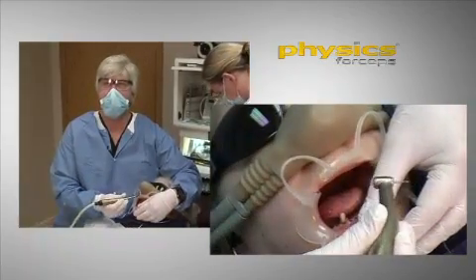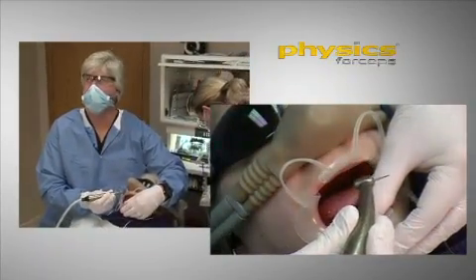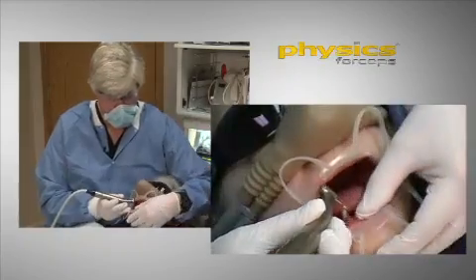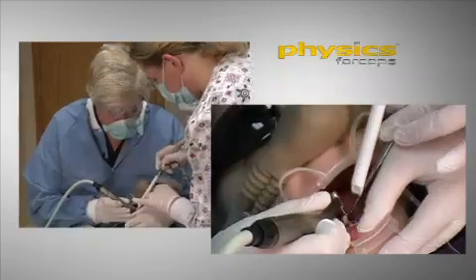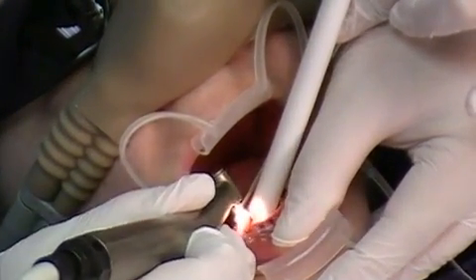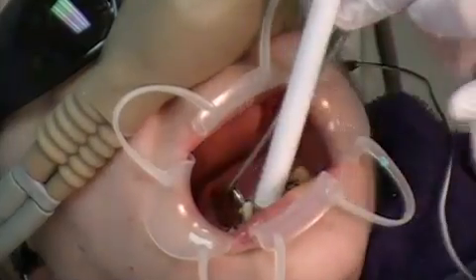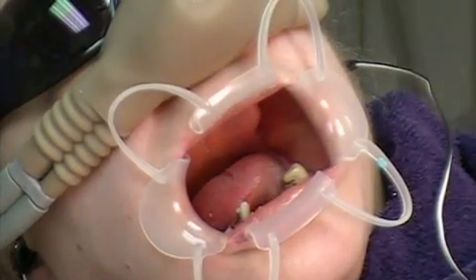So here I'm just taking a surgical burr, a carbide — 557 surgical burr — and I'm going to come up. Come back here on the lingual, and I'm just going to remove, just flatten that surface a little bit. And sometimes that just makes our job a little bit easier.